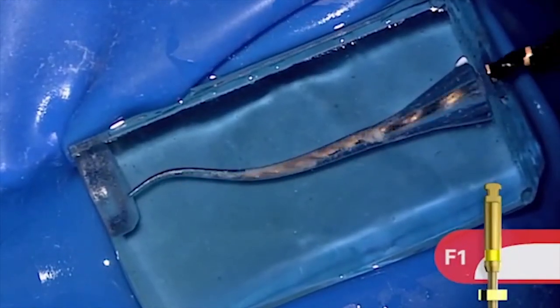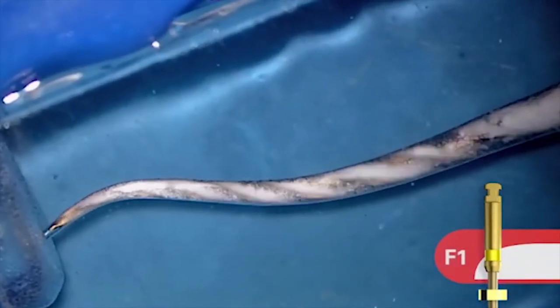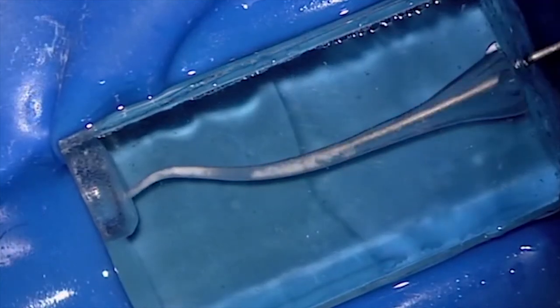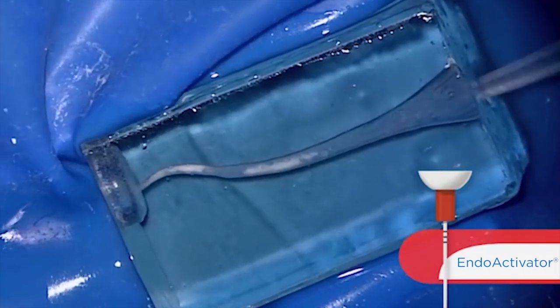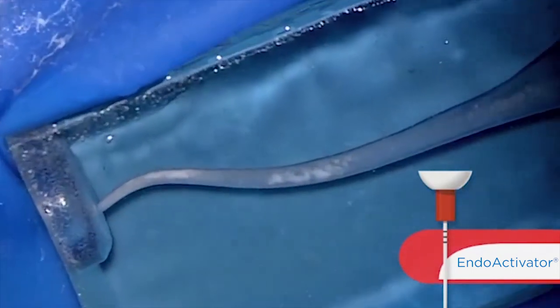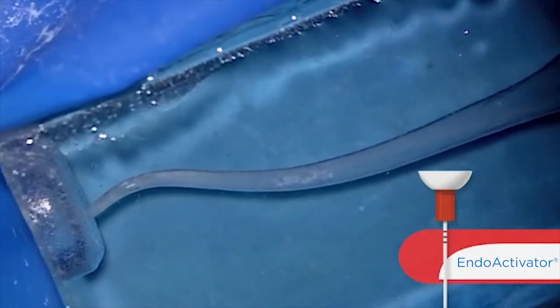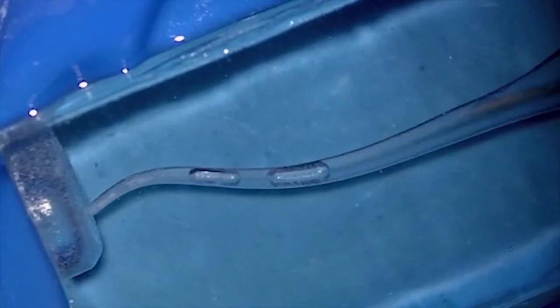Our first finisher is a 20/07 — it's F1. Notice it's loading up right towards its terminal blades, and it can walk down pretty easily, crawl around the curvature, and achieve length. We have the usual assignment of irrigate, recapitulate, and re-irrigate. I'm again emphasizing that we can recapitulate even with an endoactivator as a third idea. So we've talked about a stainless steel 10 file and a ProGlider — here is a polymer, non-cutting, highly flexible tip that can rapidly move debris into solution and very effectively clear the canal so that we can irrigate more effectively.